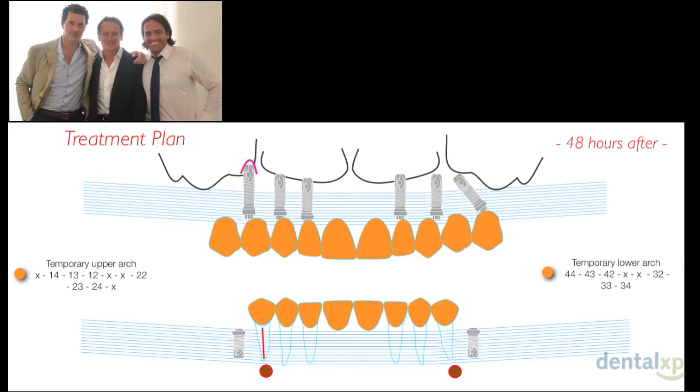So it's going to facilitate our work, and I think improve the quality of life of our patient, who is not going to work out with a denture, and is going to work out already with the correct occlusal plane, which I think is really important from the beginning.